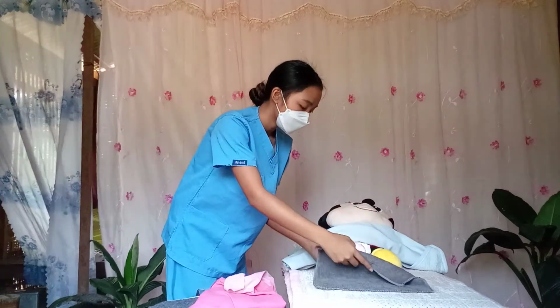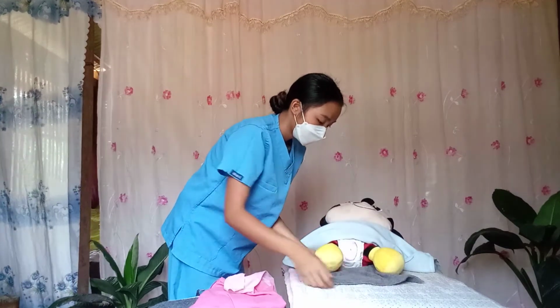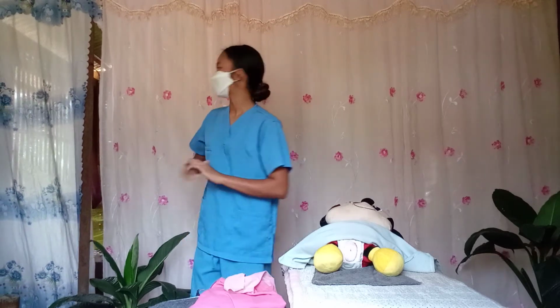Thank you so much. Okay, the next thing that we are going to do is provide a direct light for the patient. This is to provide good visualization upon doing this procedure.